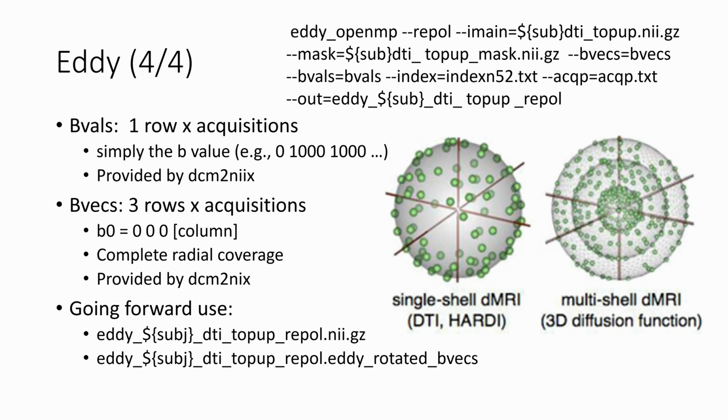So when you're going through each of those scans, you're peeking down a direction this way, down a direction this way, and you're going, not randomly, in a pseudo-random order, across directions, so you're not constant. You can imagine if someone went through a coughing spell, they would knock out a lot of adjacent directions. If those are all collected in sequence, you would be blind to one direction in space, of one white fiber direction. But since you're sampling somewhat at random, you can interpolate back to the one that you missed: if you had 3 spots surrounding it that are all showing a strong signal, you can expect that the one that you're missing would also show a similar strong signal. So you can interpolate it that way, rather than just going slice above, slice below.